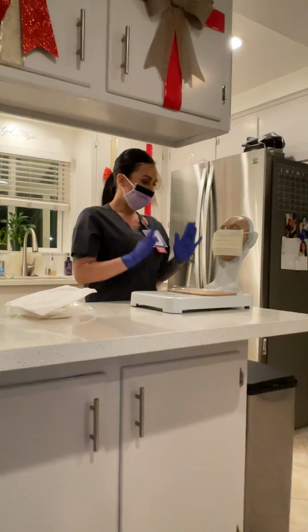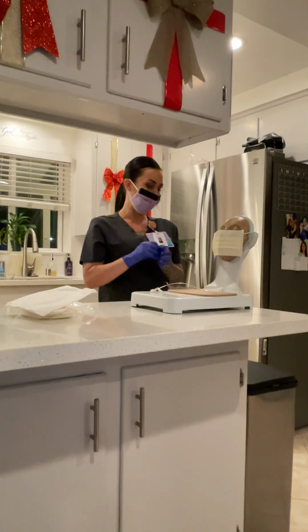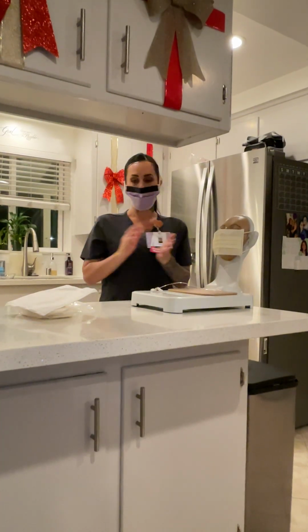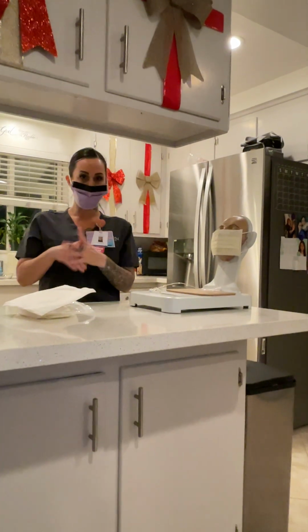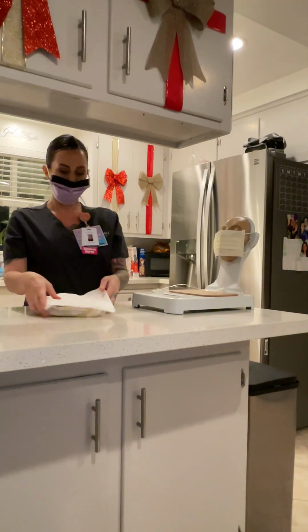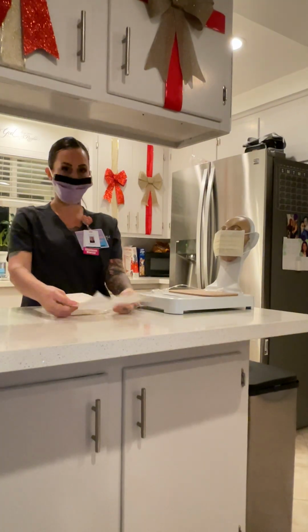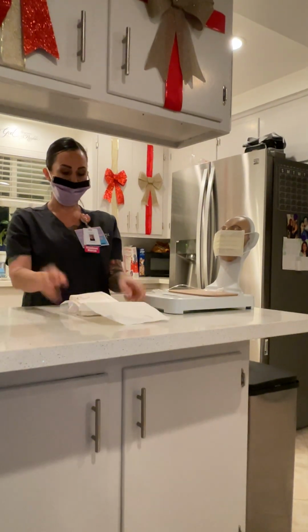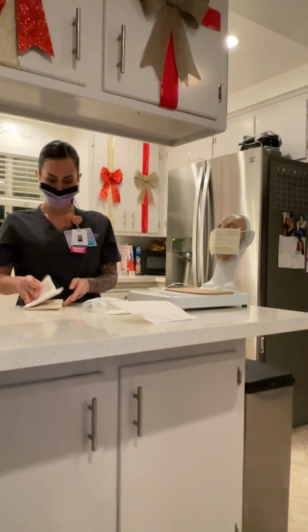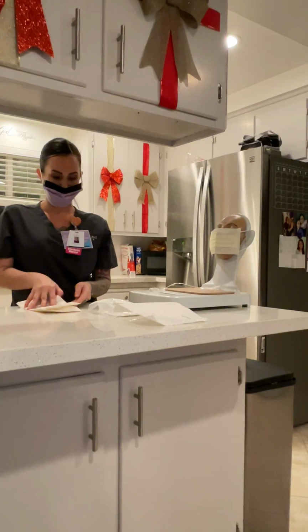All right. So now that we've looked everything over, we are going to want to remove our dirty gloves. We're going to want to perform hand hygiene. Okay. Now we're going to pull out our new catheter kit here. I'm going to pull out the sterile gloves. Move that out of the way.